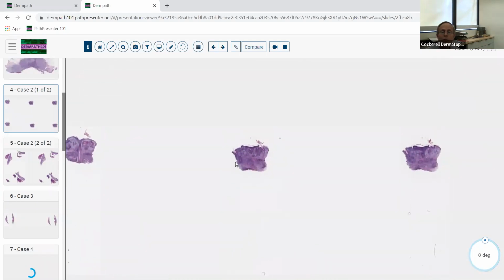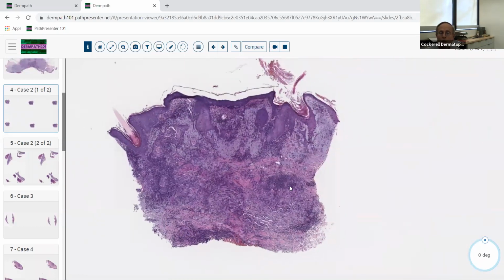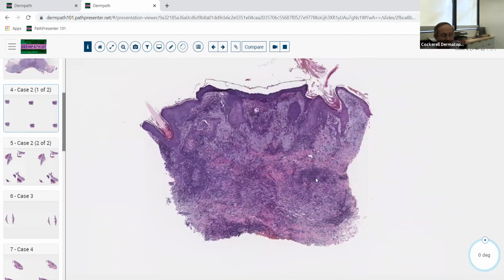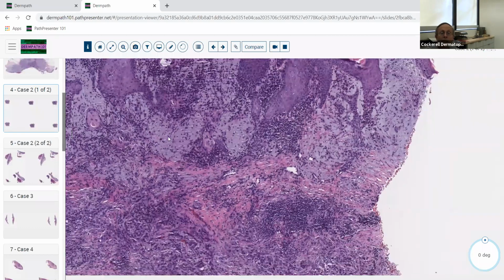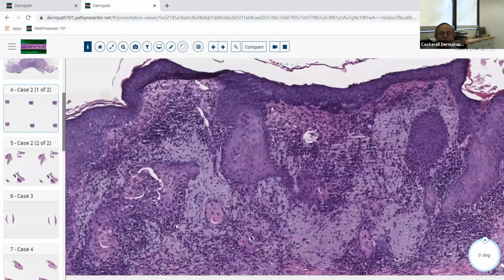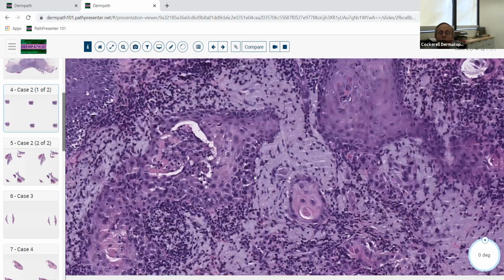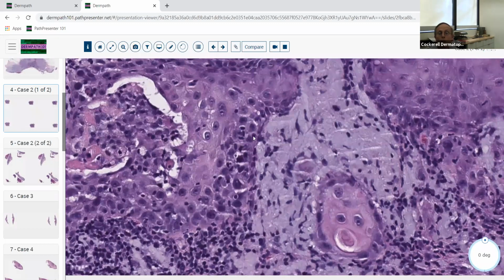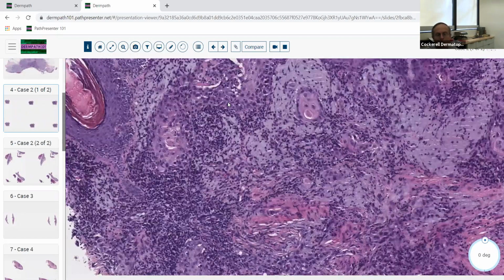I think we have actually two different biopsies, and here we've got a punch biopsy, and a much smaller situation here, so we don't have the broad ability to assess breadth, symmetry, circumscription, things of that nature. So we've got something that was punched into the middle of the lesion. And you can see it's got this irregular epidermal hyperplasia, and then in a couple of areas, not contiguous with the epidermis, at least here, we've got these aggregations of atypical squamous cells with obvious squamous differentiation, with irregular, hyperchromatic cells, and some scattered mitotic figures. So this is a punch biopsy out of the middle of a squamous cell carcinoma.